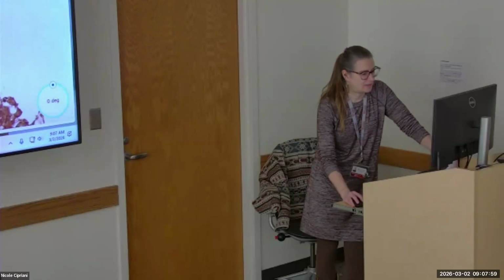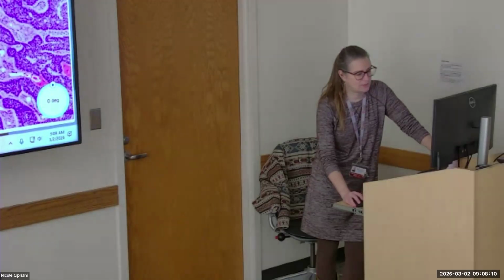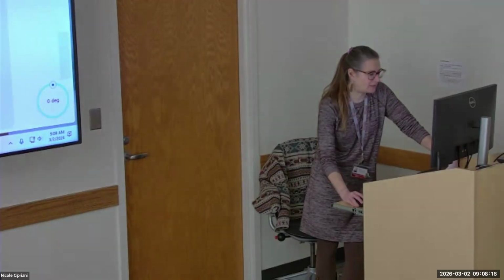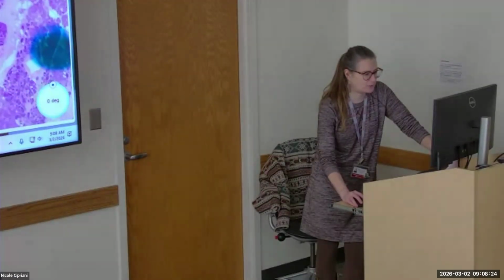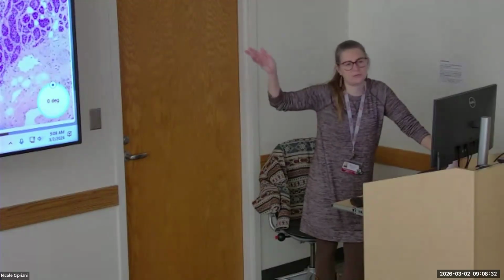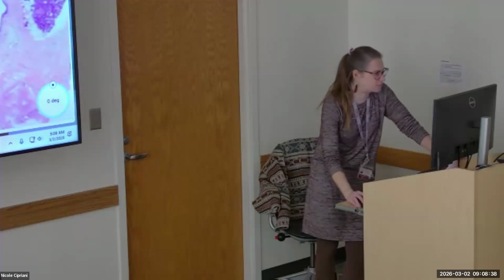Here's beta-catenin by IHC. So this was a frozen of it. This is the resection of it, showing the same morphology with these beautiful tubulotrabecular basaloid structures and this spindled cellular S100 positive material. So basal cell adenoma versus basal cell adenocarcinoma, the only difference is it has infiltration, right? So mostly the similar tubulotrabecular morphology, hyaline basement membrane material in the form of these little globules, and infiltration out into normal. So adenoma versus adenocarcinoma is basically infiltration.